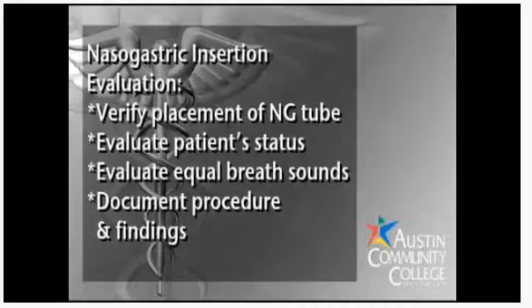During my evaluation phase, I want to evaluate placement of the nasogastric tube, the patient's status, and also to make sure that the patient has equal breath sounds.